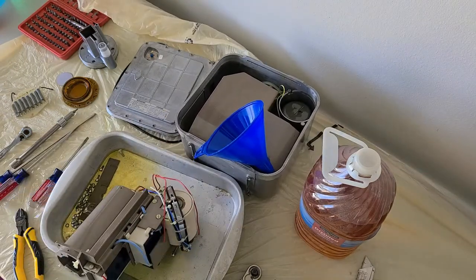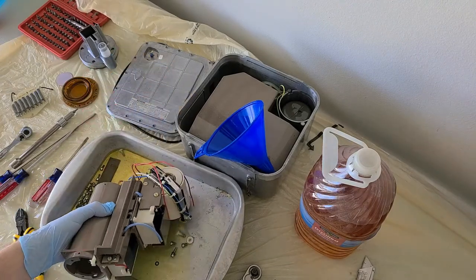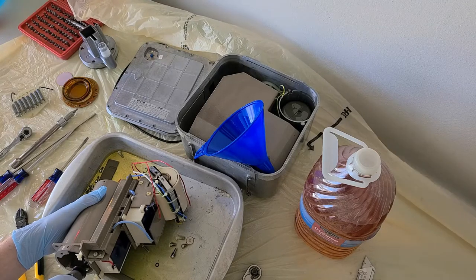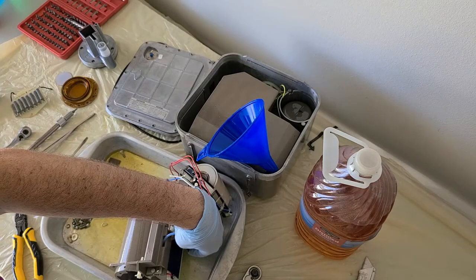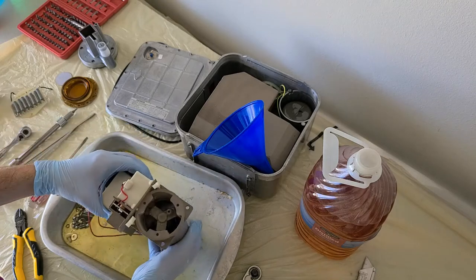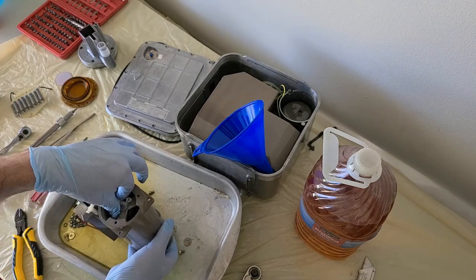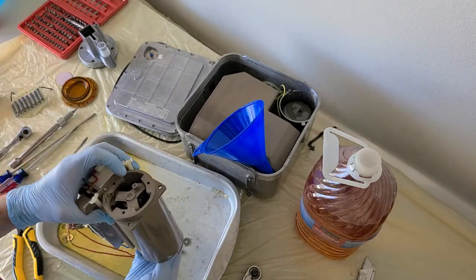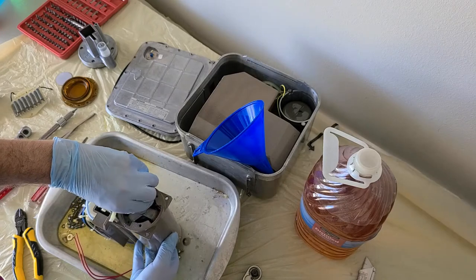All right, in order to not break the tube trying to get it out, there's a little metal slot in here that's in the way, so I'm going to have to just remove a couple nubs so I can slide it out. All right, moment of truth, let's see if that made enough room to where I can twist it out. All right, making some progress. There we go. You ready to see the tube for the first time?